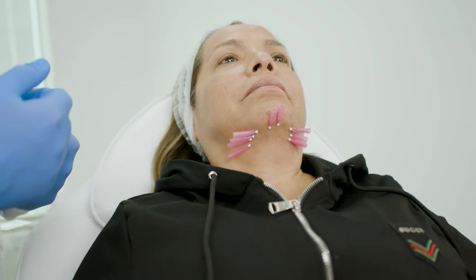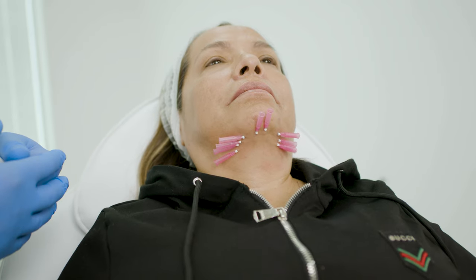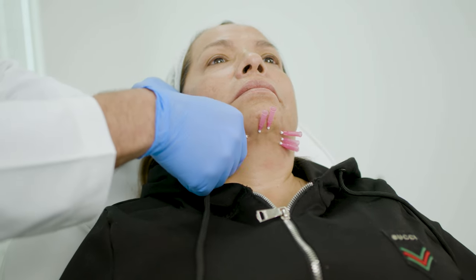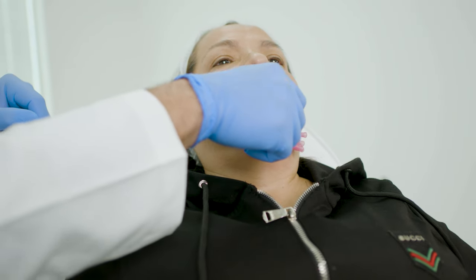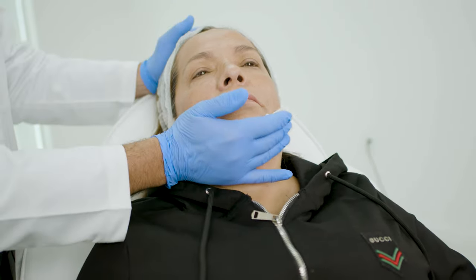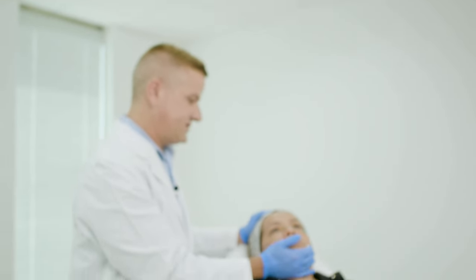This is a quick, easy procedure to learn. We include this in our PDO class with Empire Medical, and we hope to see you in one of our classes soon. To remove the threads, we just do a slight twist — we remove the needles and the threads stay in place. As I placed the threads, I was careful to make sure they were placed all the way in. We'll hold gentle pressure on the site just for a couple of minutes after to minimize any chance of bruising.